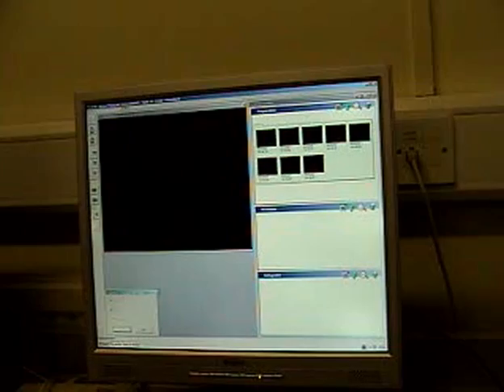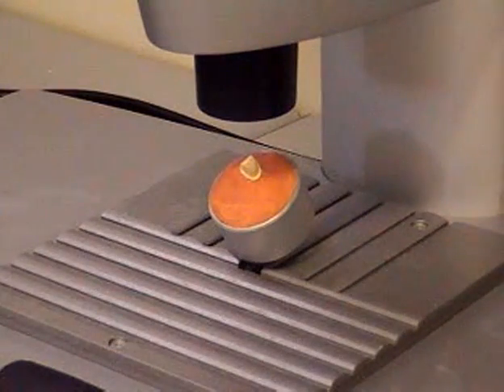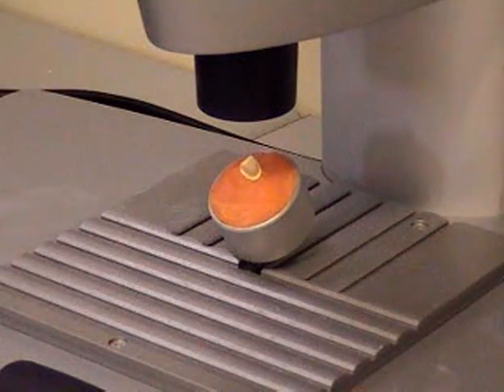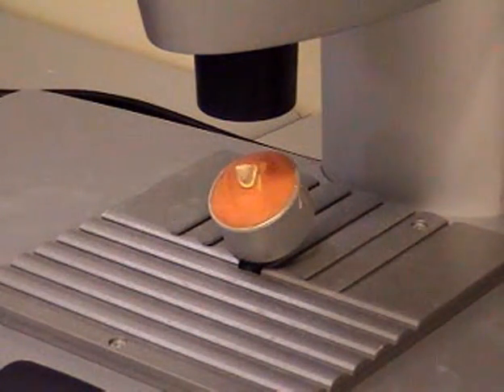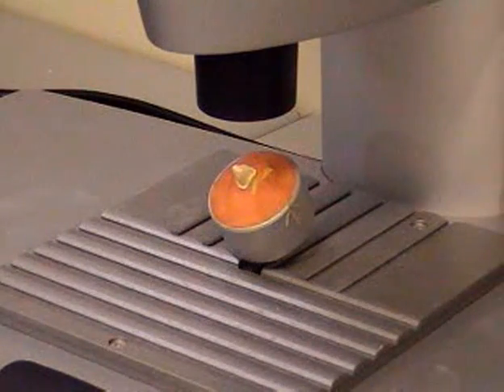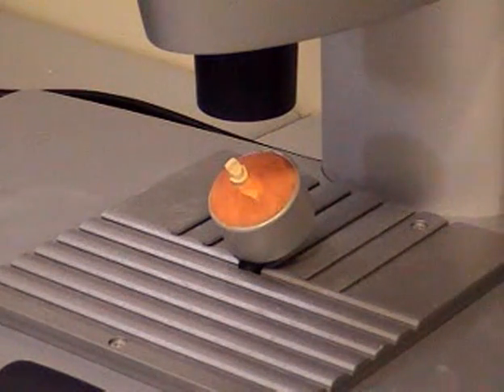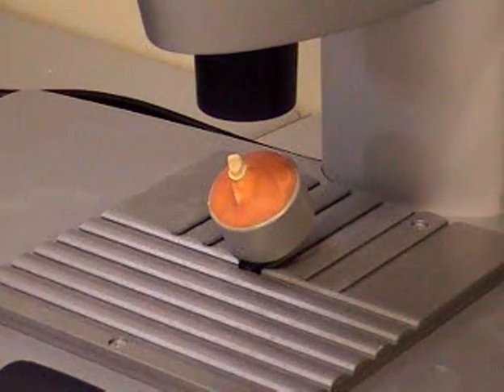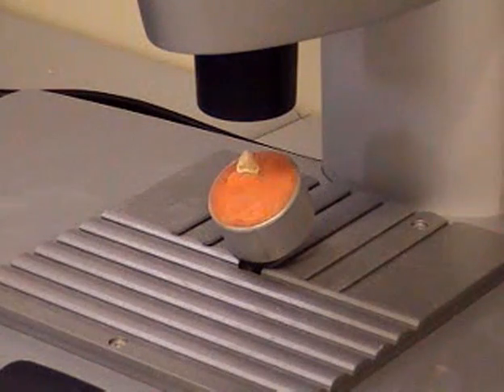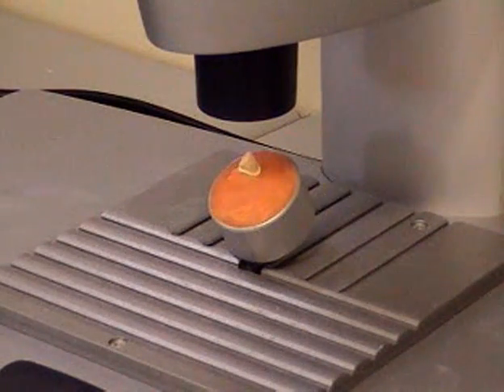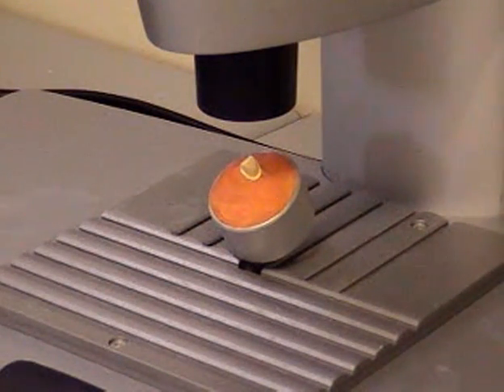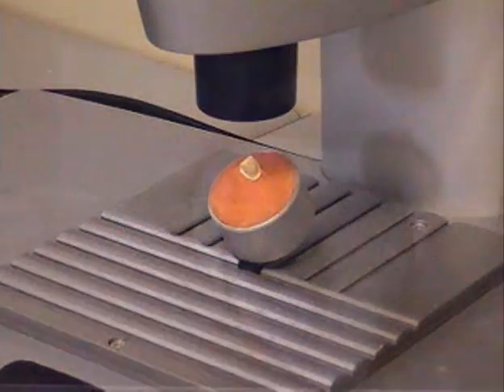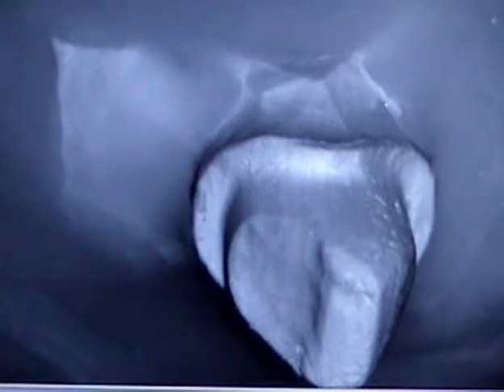One bit that you didn't see was that we had to focus the scanner there down onto the die to get a nice sharp image. This is just repeated just so that you can see what happens on the scanner. You don't normally do it twice. And we'll show you in a second in close-up how the scanner catches the image. So you'll see it as though you see it on the monitor now.